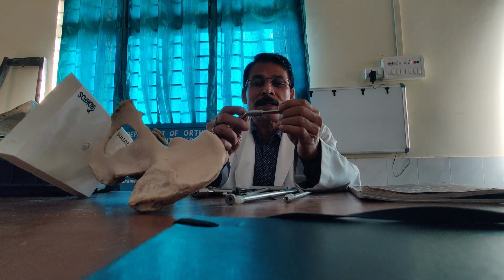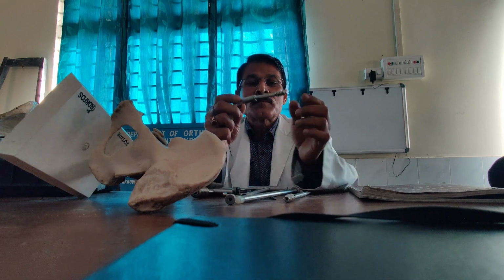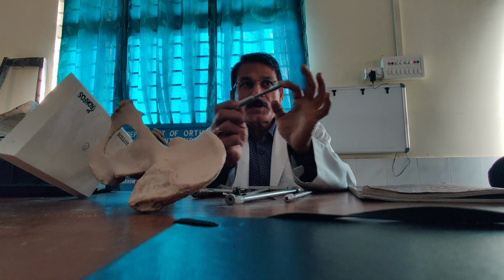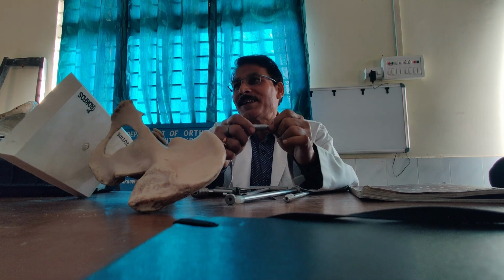And how much should be there inside the barrel? Again, this is an important thing. See, there are two things. Supposing I am applying this device like this and keeping the plate just like this, and then if the force is working, it is stuck, it will not allow it to go. Got my point? That means a certain amount of your screw should be inside the barrel to be effective.